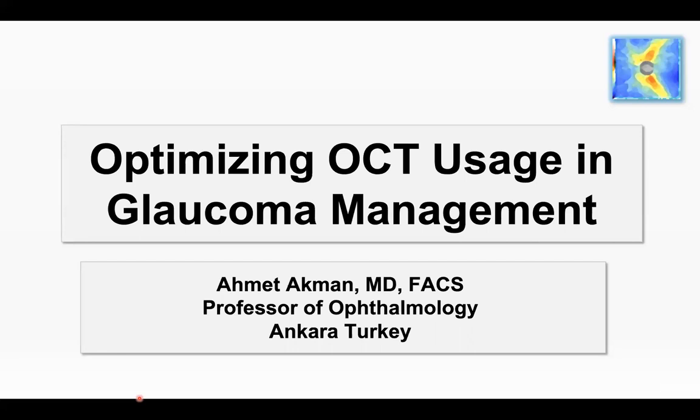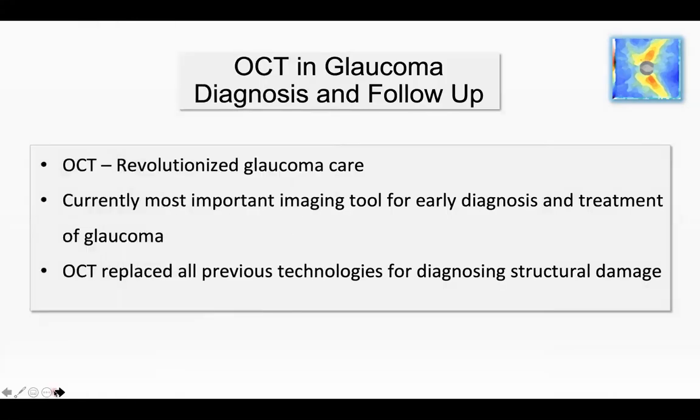Now let's start. This webinar is about optimizing OCT usage in glaucoma management. So instead of going into details in the literature data, I will try to concentrate on the practical aspects and practical usage of OCT in glaucoma management with interesting case examples. OCT in glaucoma diagnosis and follow-up.